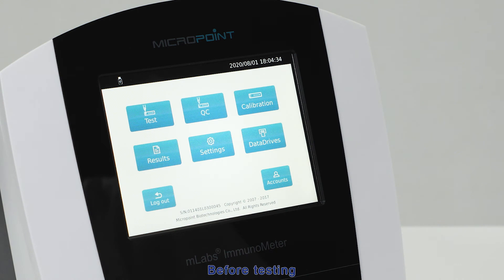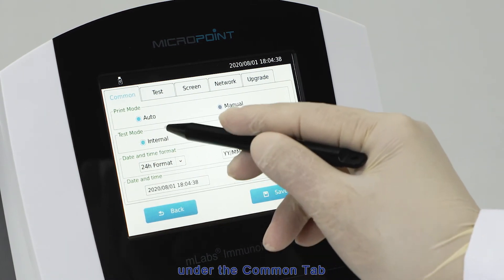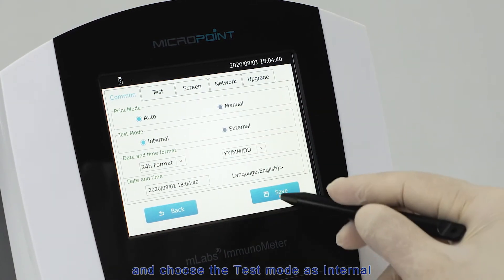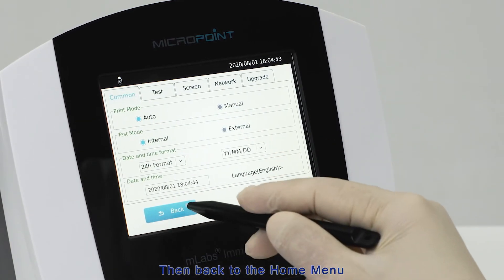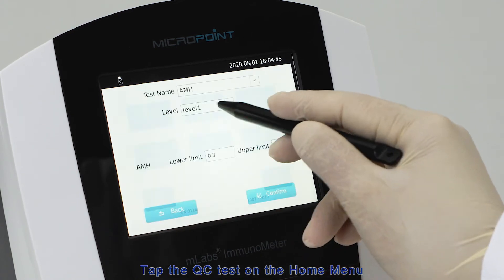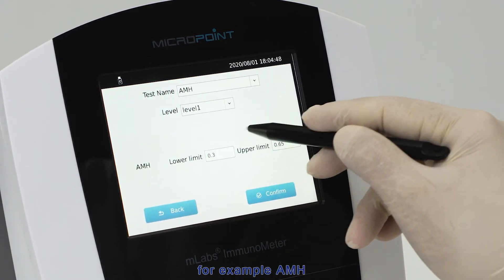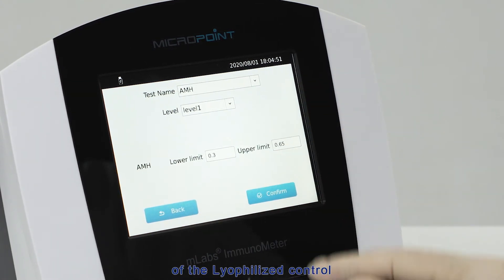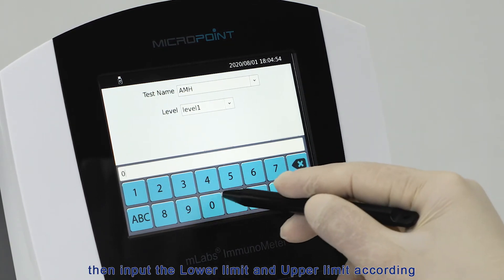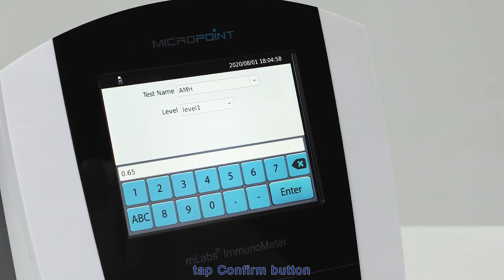Before testing, ensure that the M-Labs Immunometer setting is in internal test mode. Tap Settings on the home menu, under the master tab, and choose the test mode as internal. Then go back to the home menu. Tap QC Test on the home menu, choose the test item — for example, AMH — and choose level 1 or level 2 of the lyophilized control. Then input the lower limit and upper limit according to the label on the lyophilized control bottle, and tap Confirm.